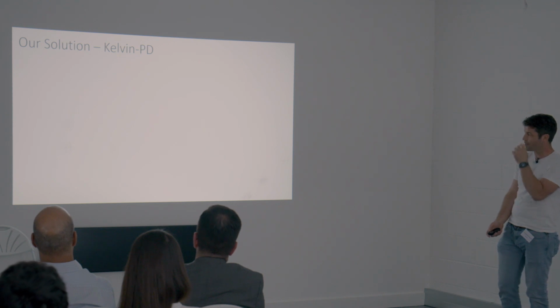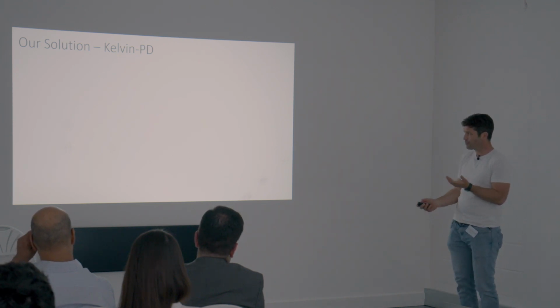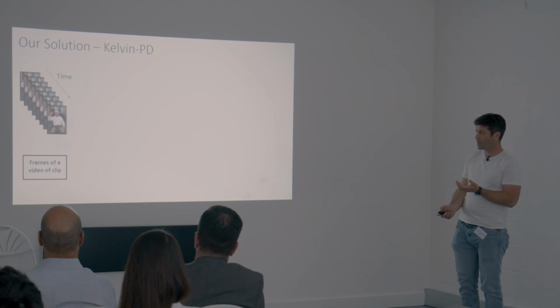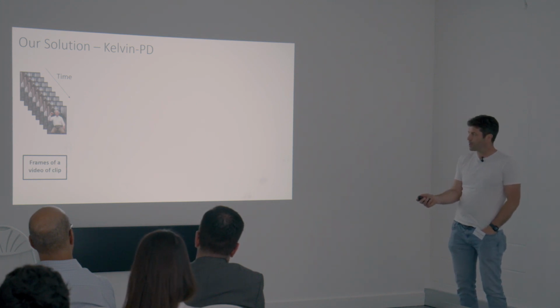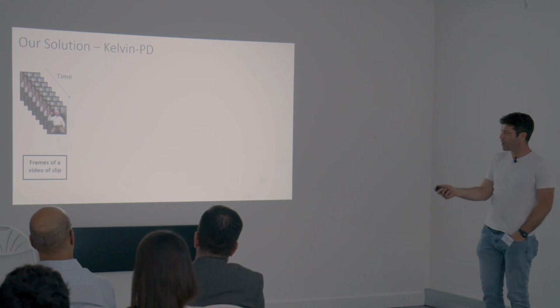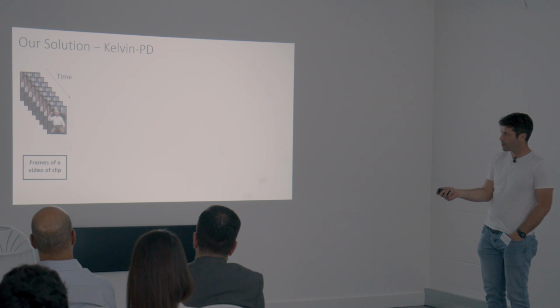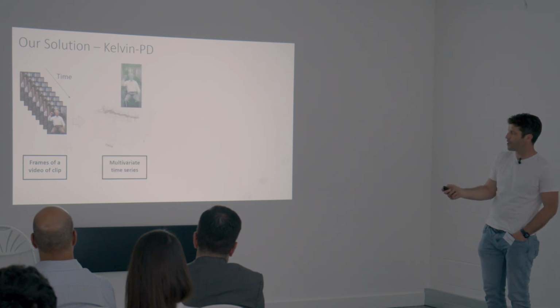But to get back to the machine learning side of understanding behavior, our approach can be understood relatively straightforwardly, I think. If you think about what a video is, it basically consists of multiple frames at regular intervals, and over a period of time that captures the information around some kind of movement, in this case for a patient.